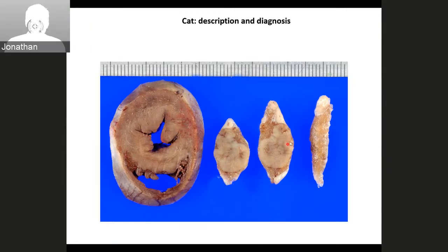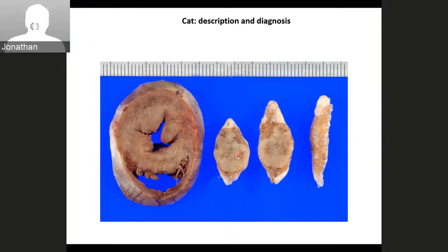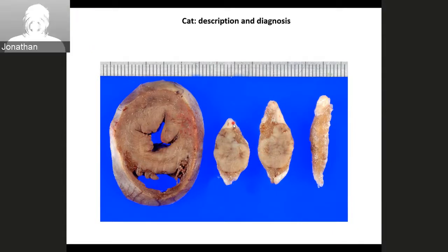Here there is not a pattern of cortex and medulla. Look here, that's an organ, and that's another organ, very close. They stay in the neck. Oh, the parathyroid, the thyroid? That's the parathyroid, and that's the thyroid. That's the parathyroid of the opposite side. That's the capsule. And look here.